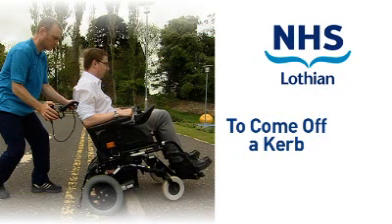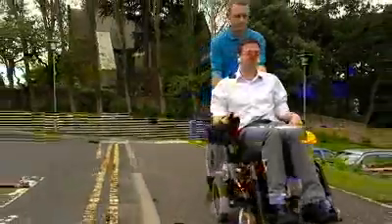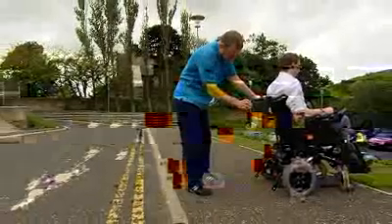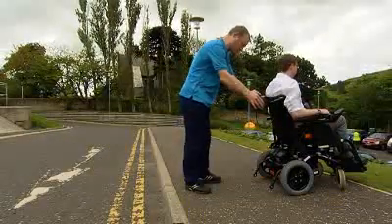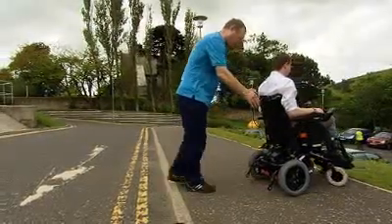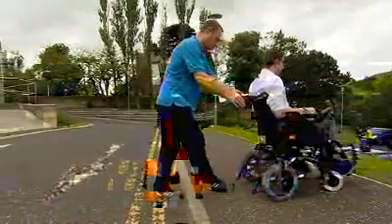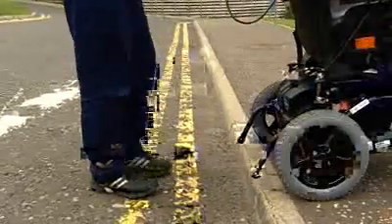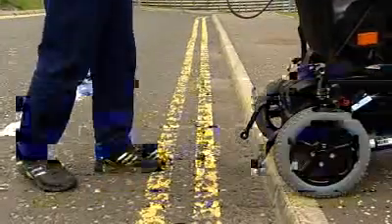To come off a curb. Before moving the wheelchair into position, the speed on the controller should be reduced. The wheelchair should be reversed very slowly when driving from the pavement and dropping down a curb onto the road surface. Firstly, manoeuvre the wheelchair so it points away from the road and back wheels line up with the curb.